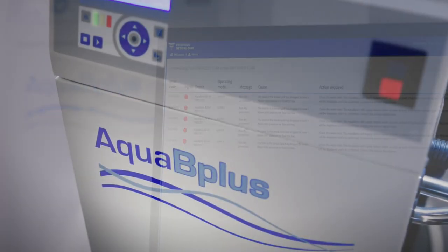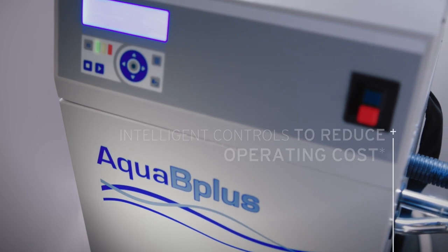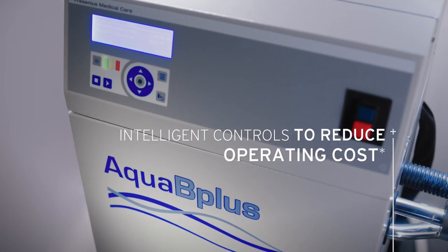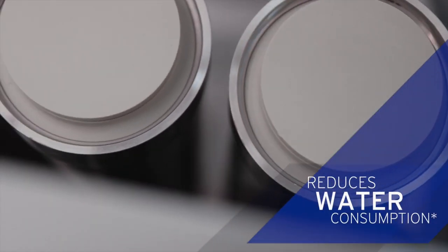If you're an administrator, Aqua B Plus optimizes efficiencies. Intelligent parameter controls reduce overall operating costs, and the unit's demand-controlled water-saving circuit reduces water consumption.